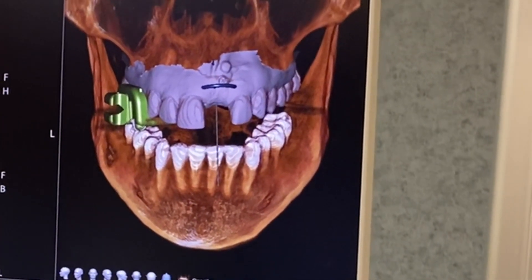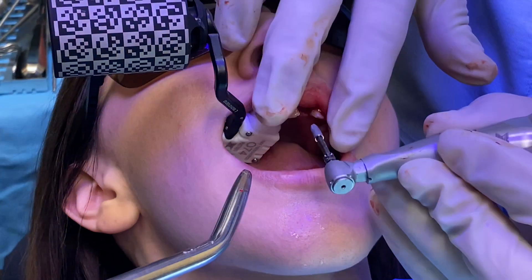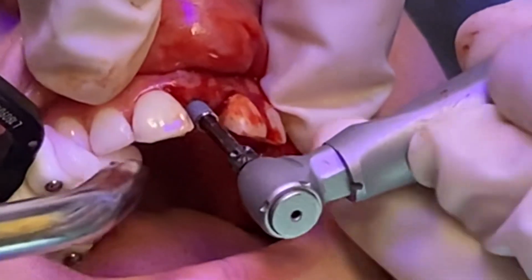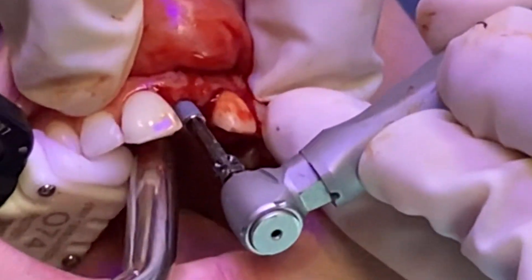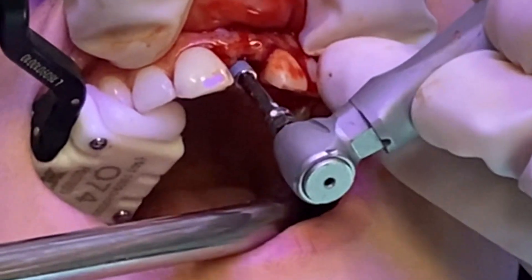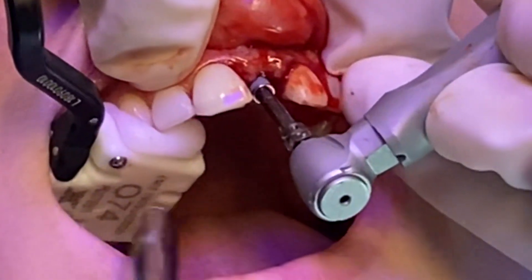And there's my hand moving. The x-ray is not on at this point — the trackers are calibrated together, and as we put the implant in, we actually do a calibration of that as well. So you'll be able to place the implant and see it along the whole time that you're putting it in.